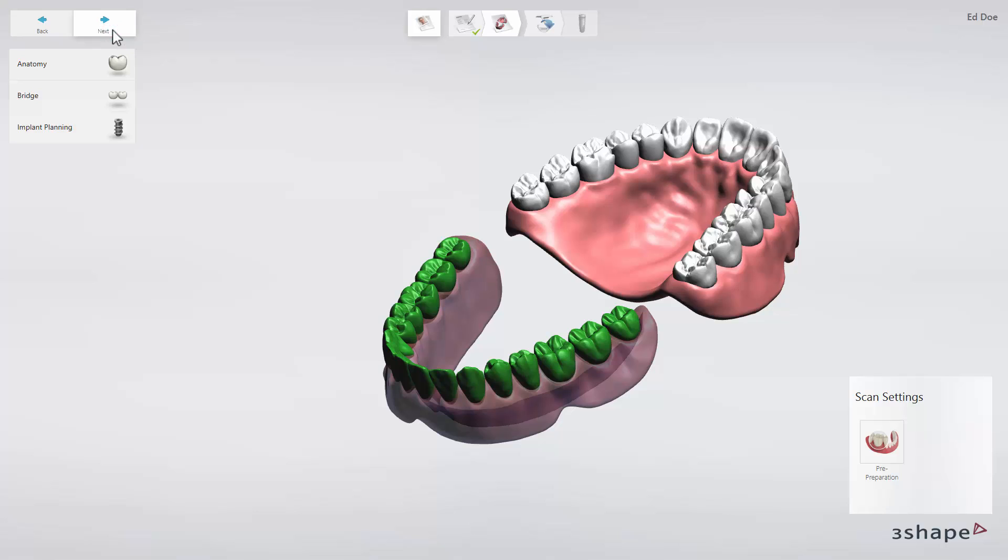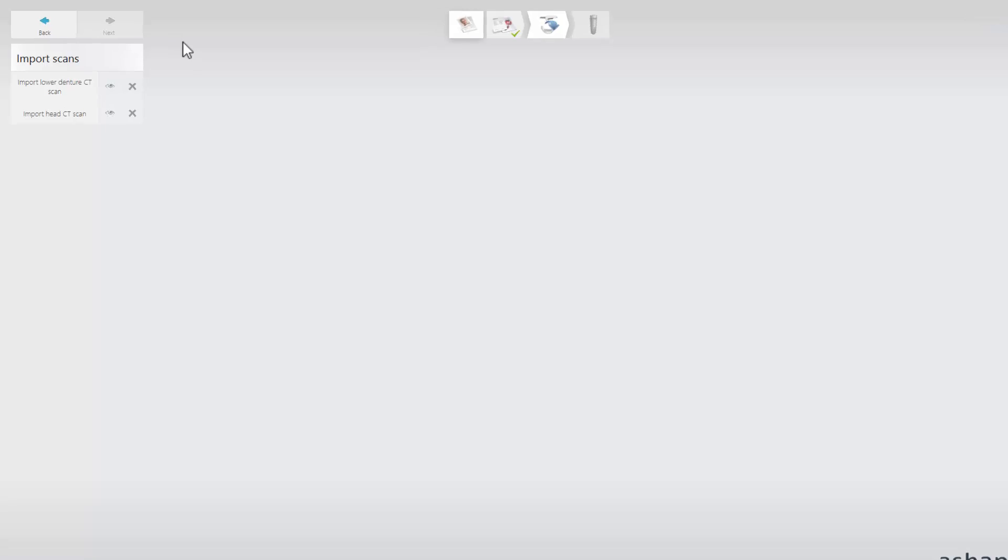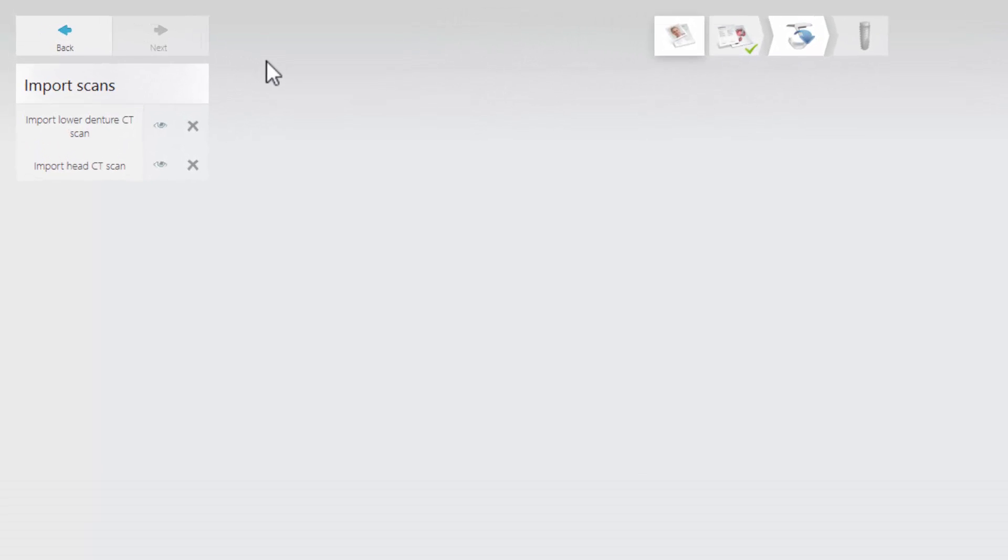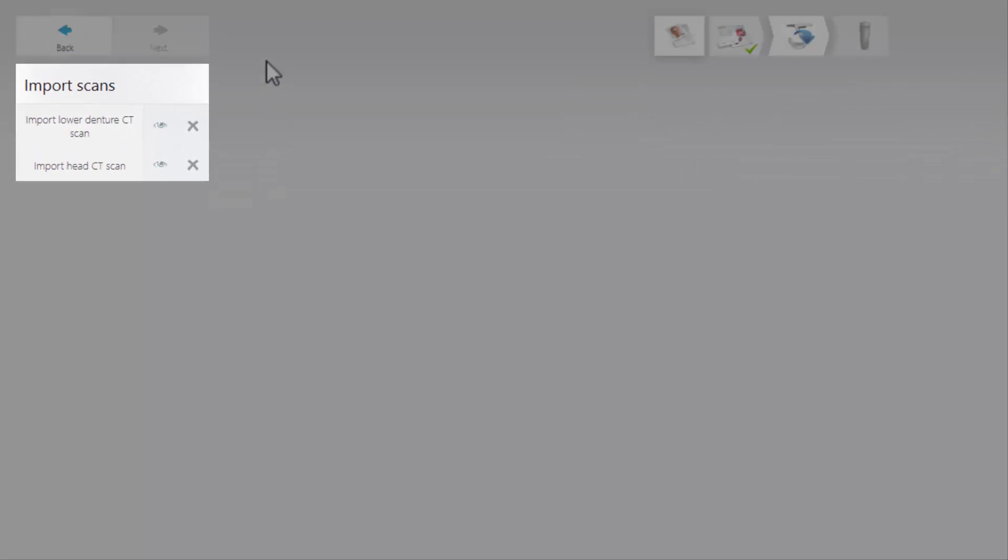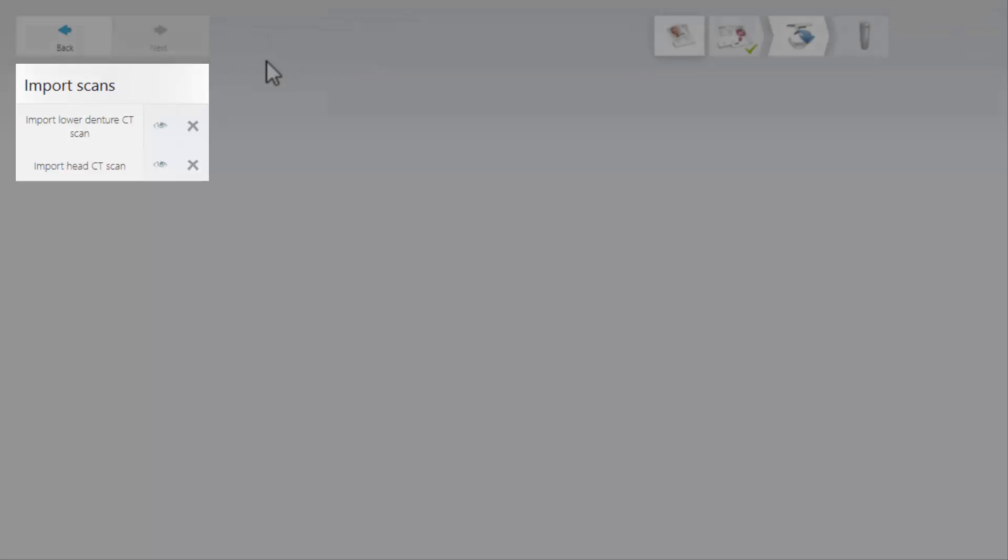Keep in mind that an Edentulous case follows a dual CT scan protocol. The Import Scan page allows you to load CBCT CT DICOM files. In our example, we will use only a lower denture and a head scan.